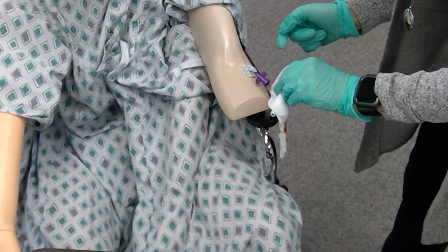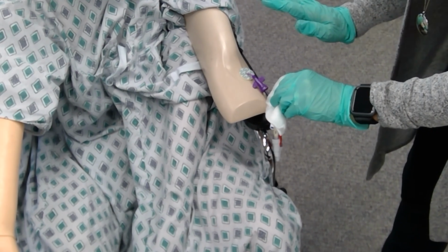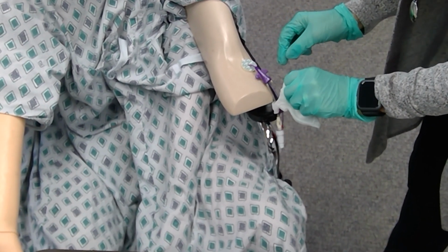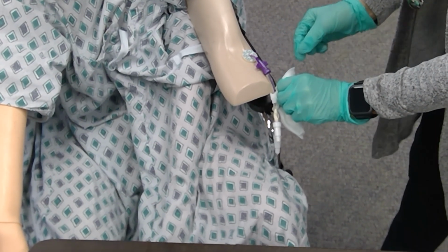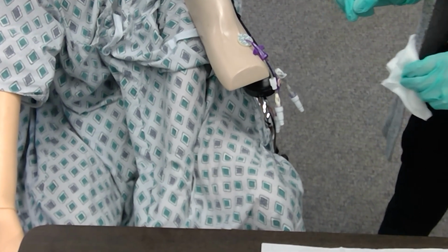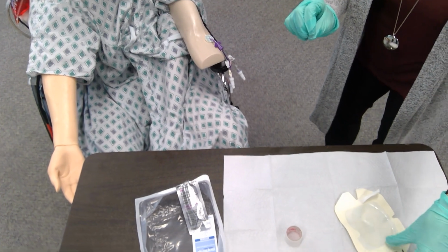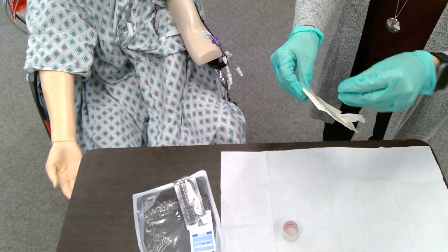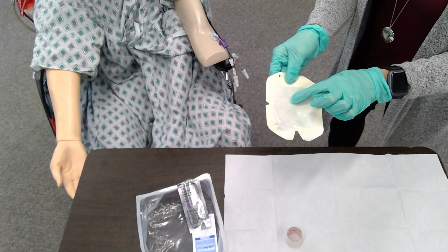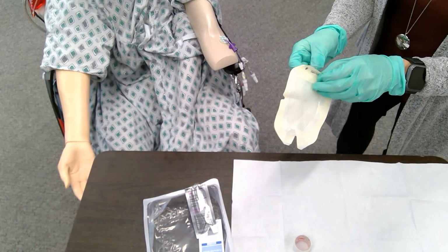Okay. So now it's time for me to put my dressing on. The skin is cleaned with chlorhexidine. My line is clean. My biopatch is on, and I'm going to set my tubing directly on that slit. Okay, since I haven't contaminated, I can pick up my transparent dressing. The insertion site needs to go in the middle, and your tubing is going to come out this slit right here.